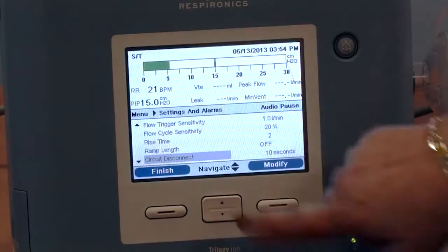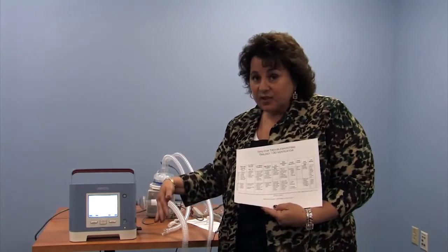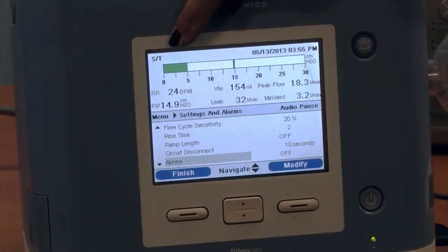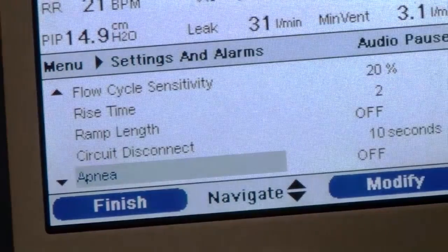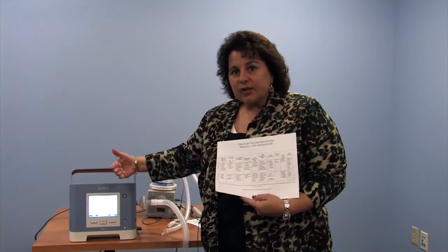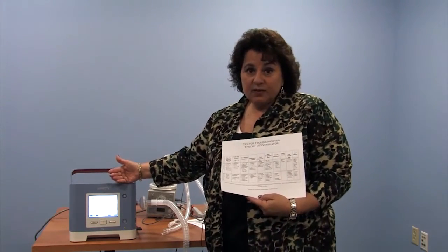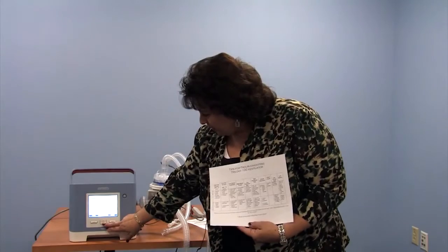So what you see here is what you saw was low inspiratory pressure. That's an internal alarm. There are some alarms that we actually set and some that are set internally by the company. Then we have an apnea alarm, so that if your child does not trigger breaths with that little circle that we've pointed out to you earlier, the machine will alarm apnea in a given number of seconds that we set on the machine. So remember that when a child's on a ventilator and they rest at night and they don't trigger breaths, that will make the apnea alarm go off. So the apnea alarm may not necessarily be used in all patients, even though it seems like intuitively you would want to use an apnea alarm.